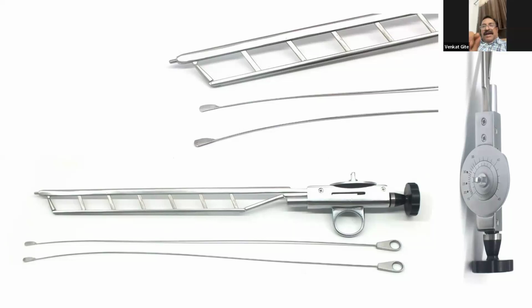Optical direct visual internal urethrotomy using a cold knife, direct visual internal urethrotomy using a laser. These are the two ways of doing the direct visual internal urethrotomy. So what is the ideal site for doing the urethrotomy? The site is definitely the bulbar urethra. Bulbar urethra, not short, above, not below.